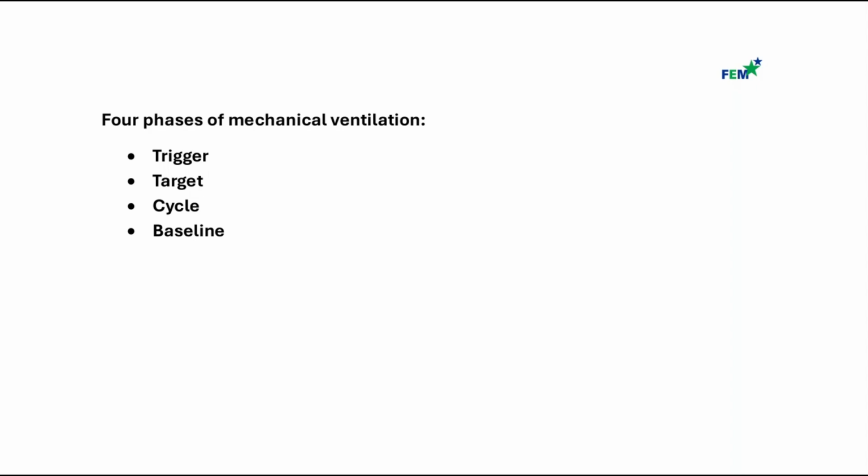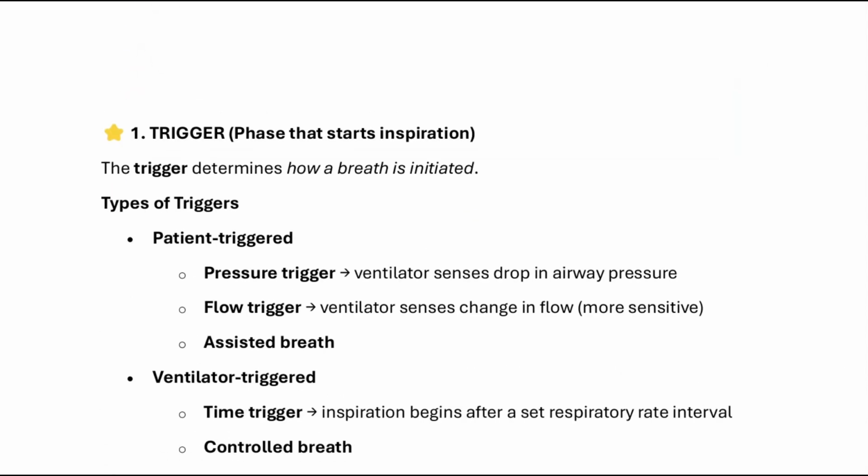For Vent 102, today we're going to be focusing on 4 phases of mechanical ventilation. What are these 4 phases? We have the trigger, the target, the cycle, and the baseline. Let's see what this means. We're going to start with trigger.